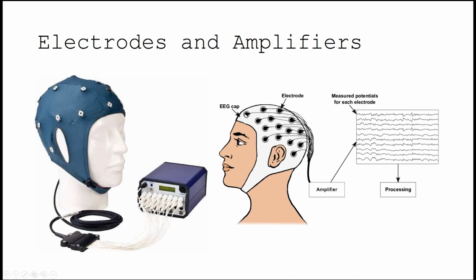There are the electrodes; they record the differential potentials. There's the amplifier, which could be large or small, and then the signal is transmitted to your EEG screen. And what you see there are the curves that we are likely to interpret in the end, be it for scientific reasons or for clinical reasons.